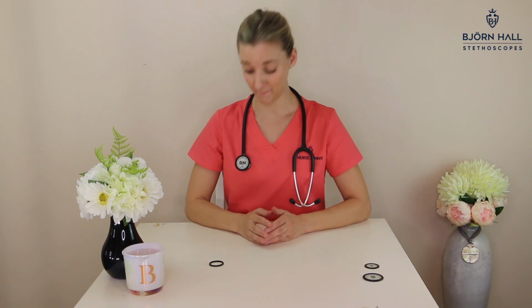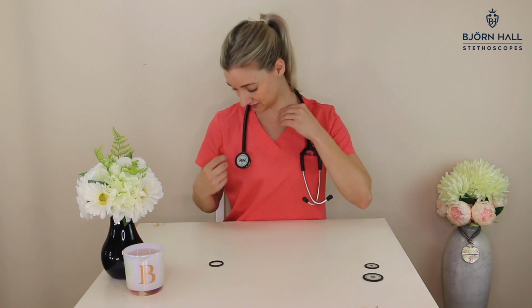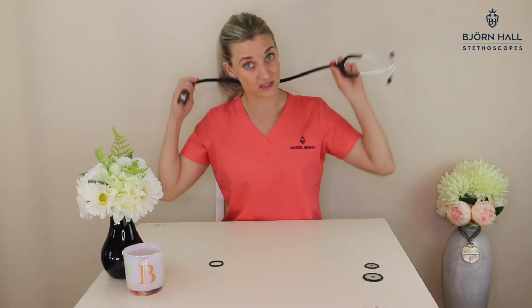Tip number 4, when you put your large diaphragm on, make sure that it is facing away from the tubing so that when you put it around your neck, the RN sign isn't upside down. With the pediatric side, I have it facing the tubing so that when I use it, the text is facing me.